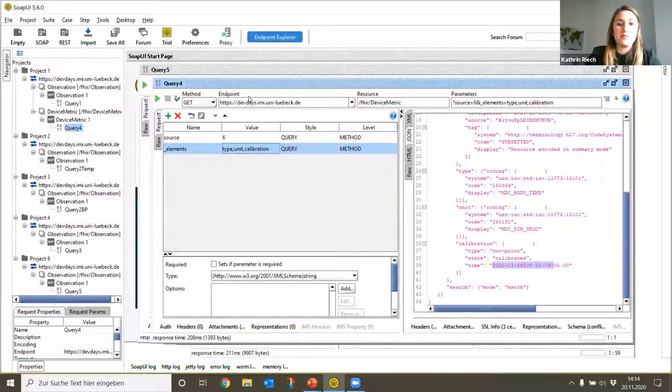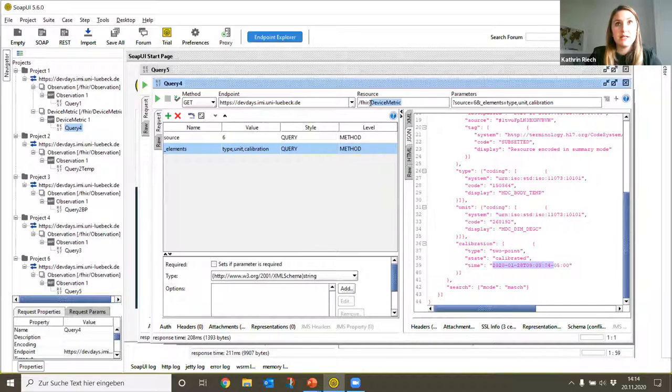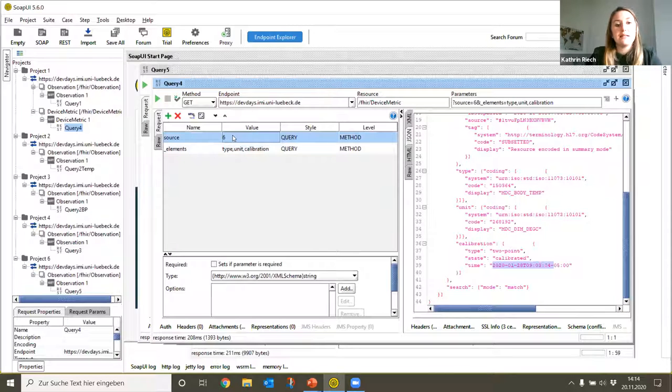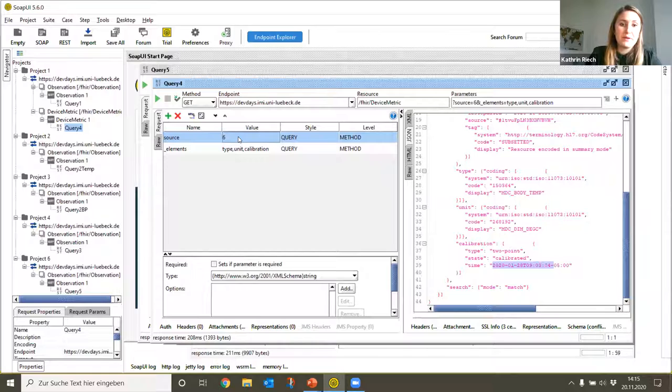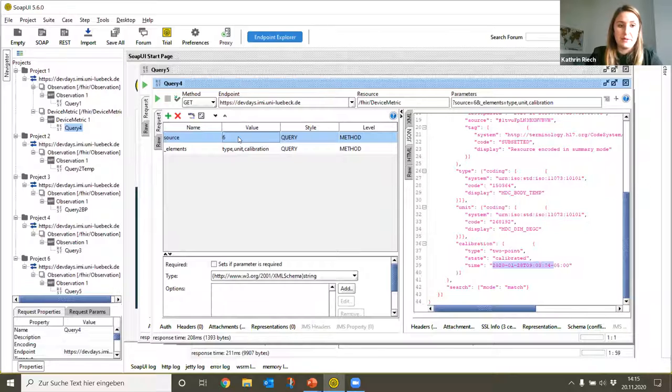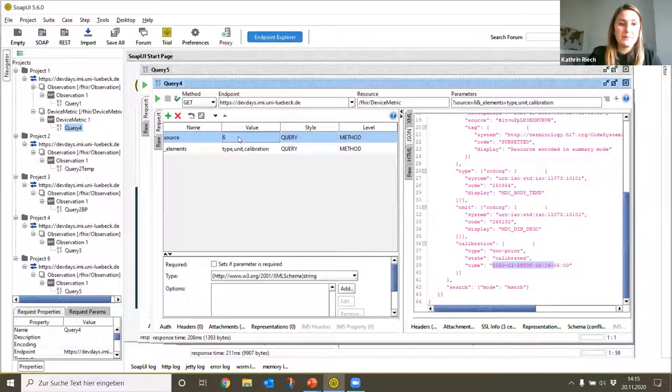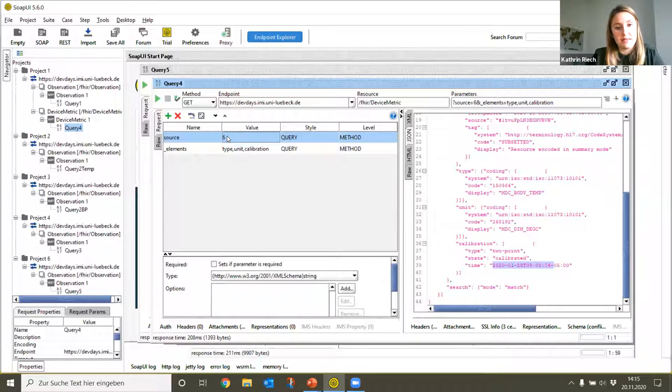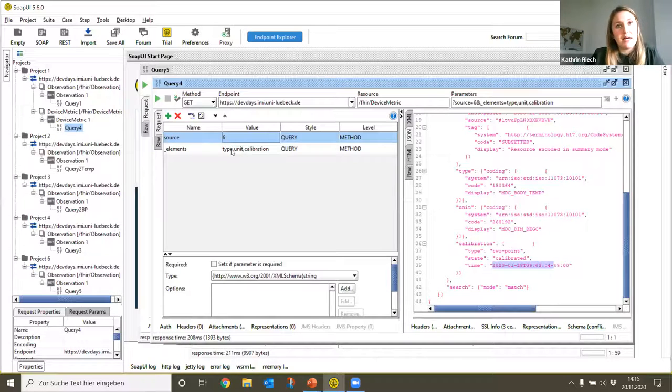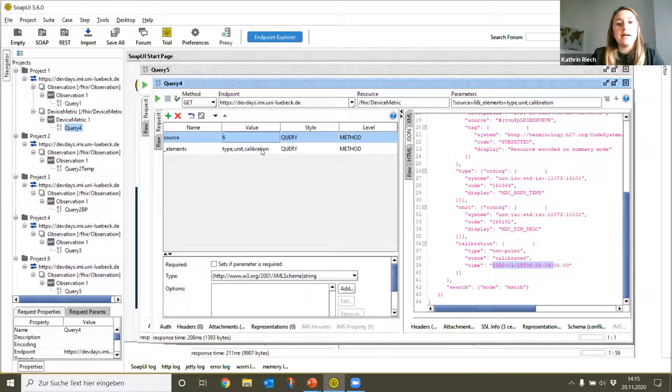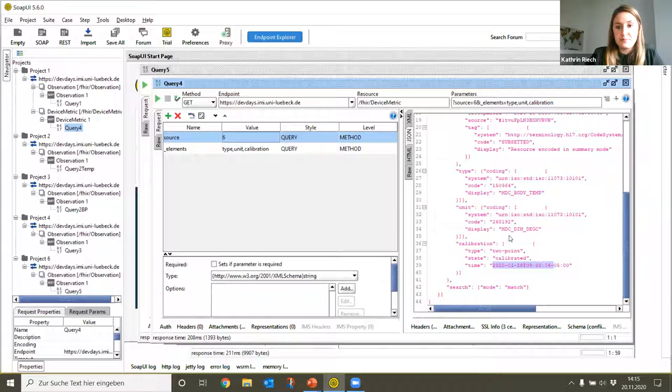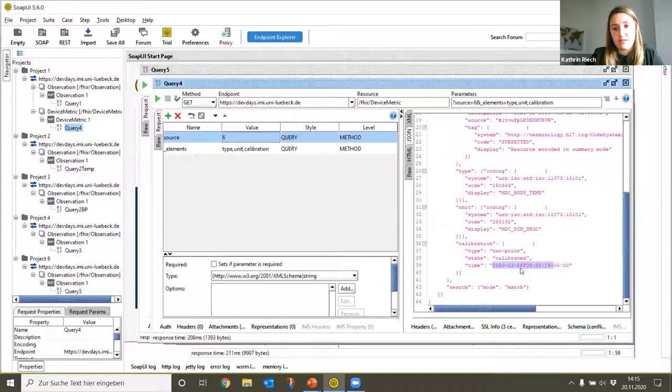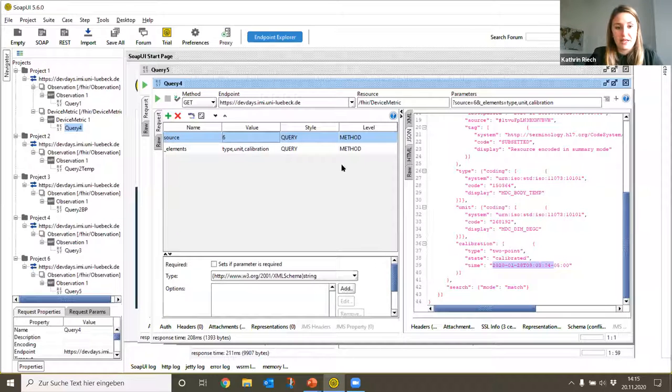The calibration information can be found in the FHIR resource DeviceMetric, and this DeviceMetric must belong to the clinical thermometer. As we have seen in our first query, the body temperature measurements have been performed by the resource DeviceMetric with the ID 22. We can see that the DeviceMetric belongs to the thermometer which has the resource ID 6. In this case we are only interested in the type of the DeviceMetric, the unit, and of course the calibration. As you can see in the output, the calibration was performed the last time about 10 months ago. So maybe someone should check this.